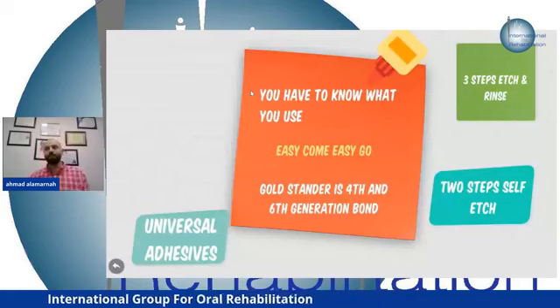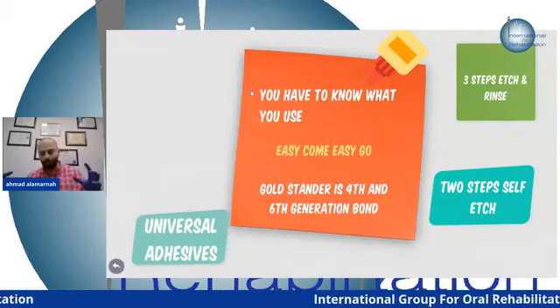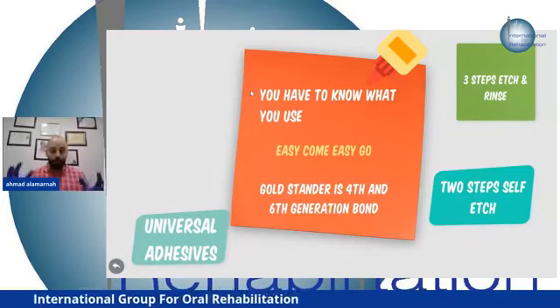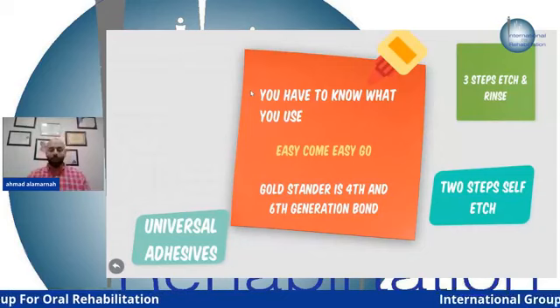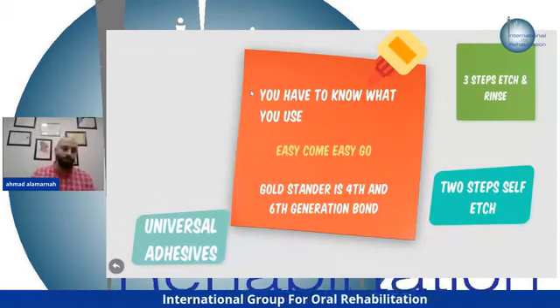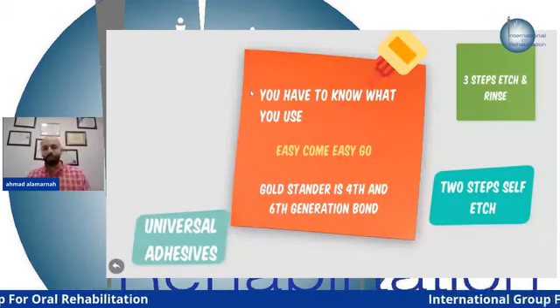We have always said that it is micromechanical bonding, a micromechanical reaction, that causes the composite to bind to the tooth. Now we can say that there is a chemical bonding with the introduction of the MDP. Okay, MDP. This is the universal adhesive.